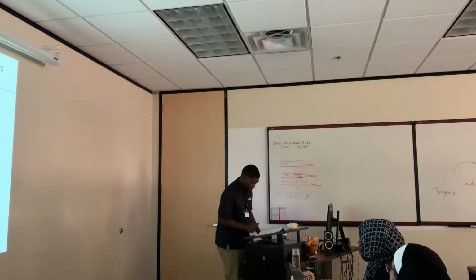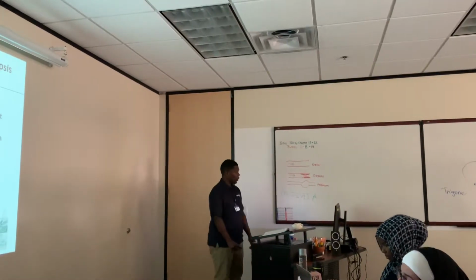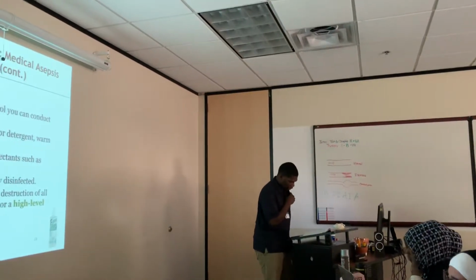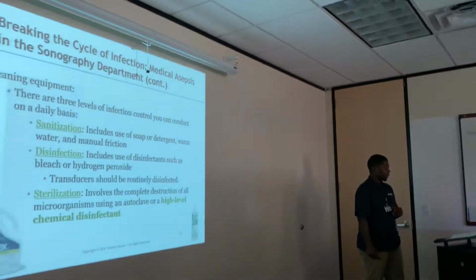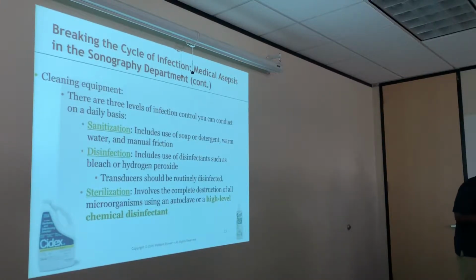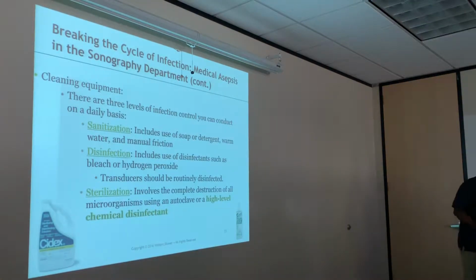So our highest level of infection control would be sterilization. It involves the complete destruction of all microorganisms, including spores, on inanimate objects. Anytime we do an exam that goes in the body cavity, such as a transvaginal, transrectal, or esophageal exam, we should always want to sterilize our transducer. Okay, so we just can't do a transvaginal and then spray it with a T-spray, and then it's going to be ready whenever it dries up.